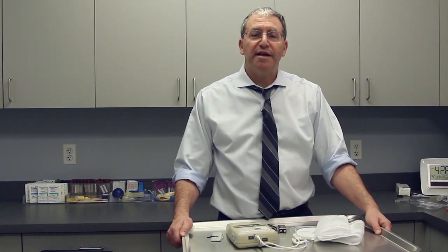Hi, I'm Dr. Michael Werner, and in this video I'm going to show you how to use the Rigiscan and also to troubleshoot some of the issues that sometimes arise. The purpose of the Rigiscan is to measure your nocturnal erections. This is important because it gives us a bird's-eye view of what's happening with your ability to get blood into the penis and to trap it.